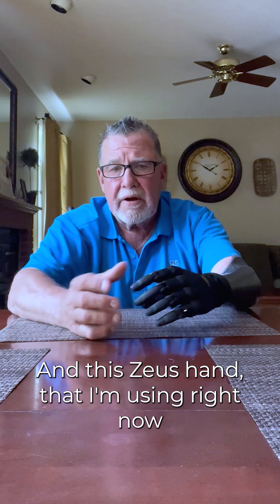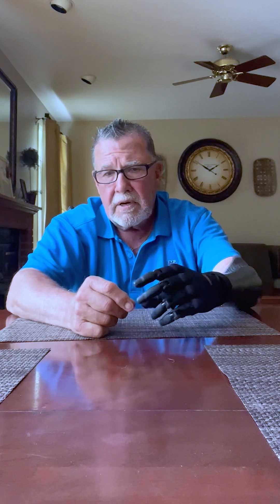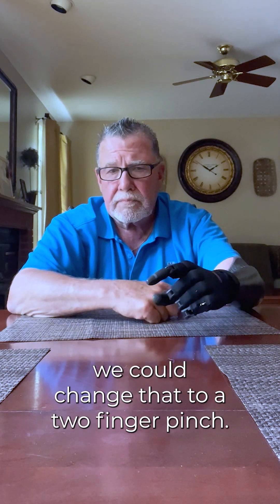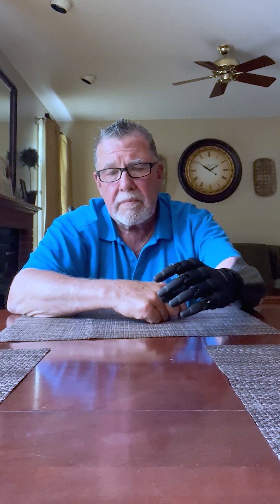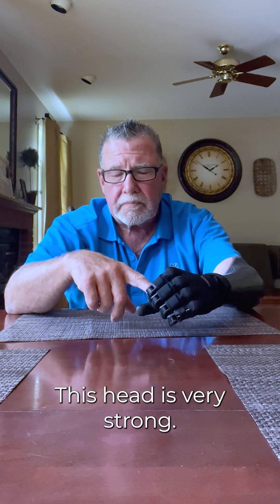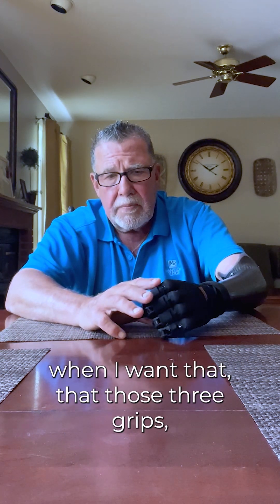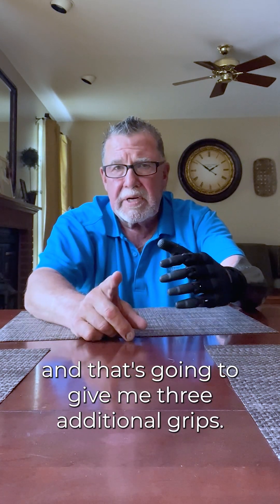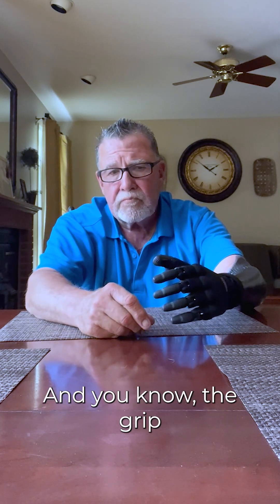This Zeus hand that I'm using right now has six grip patterns. You've got basically the three-finger pinch, and then we can change that to a two-finger pinch. And then it's got the fist. This hand is very strong. And those three grips — I can change them by moving the thumb, and that's going to give me three additional grips, including one for carrying.